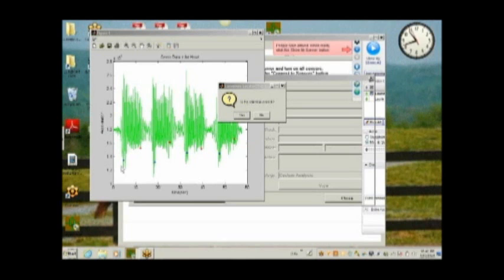In this example, the horse trotted down and back twice for 4 segments of data. In most instances, you will not need to change the selection and will answer yes if it appears that the program made a reasonable selection to include certain strides. If you would like to include more strides, you need to increase the percentage of strides included. You will select no and enter a delta value greater than 0.1, such as 0.15 or 0.2.